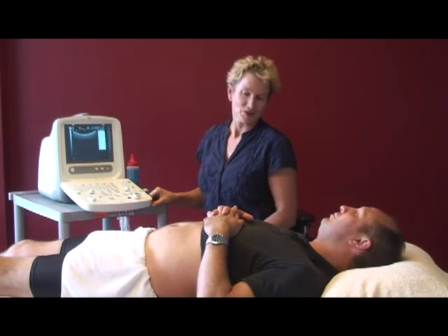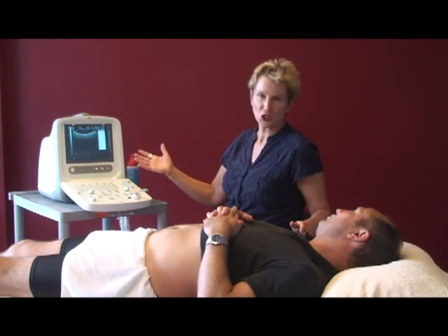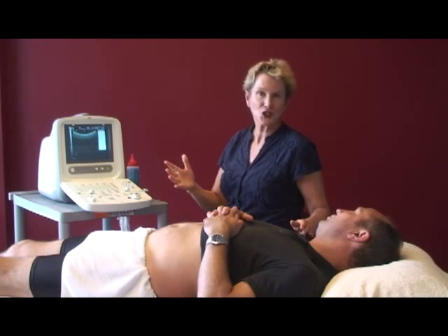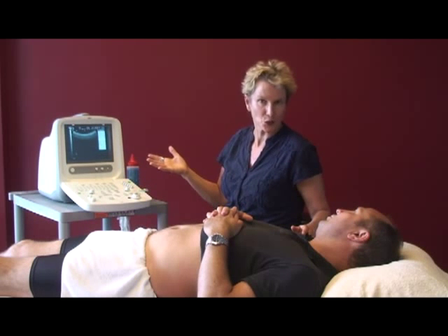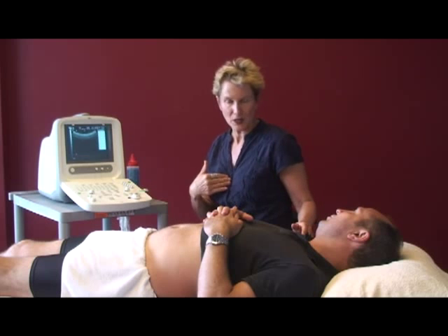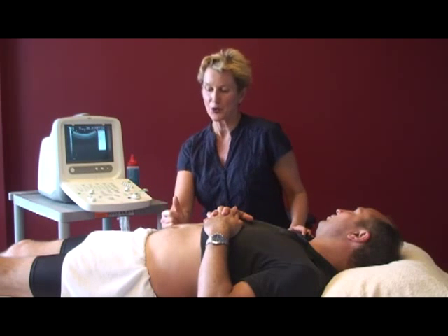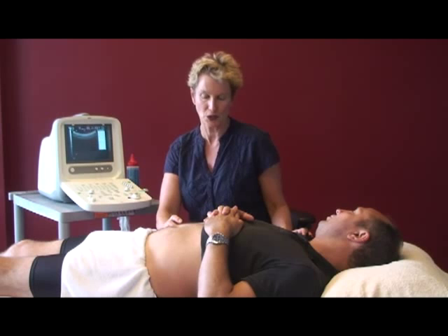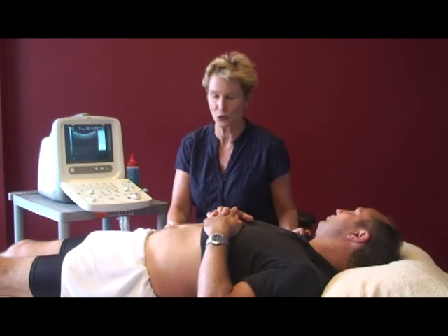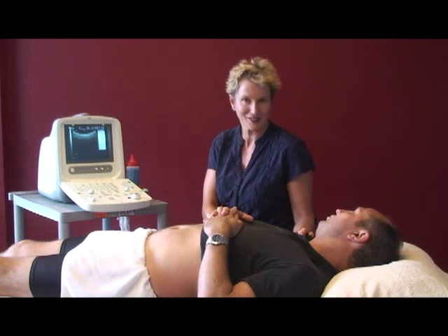So the first one is the client must be able to see the machine. You're assessing them, they need to be able to look at what you're seeing, and that will be how you're retraining them. Where you are sitting is important, or you may be standing, but when you start using the machine, it's very important where you are so you're not hurting yourself, so you've not got too much twist on you. You need to be able to work the dials, see the machine and the client as well.